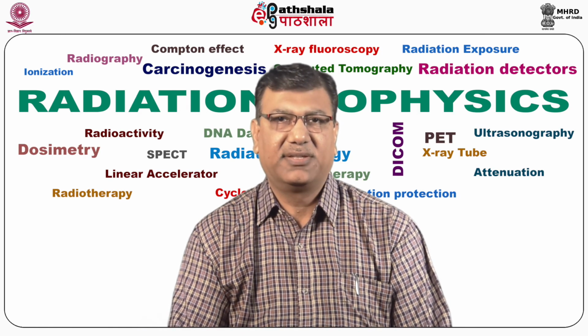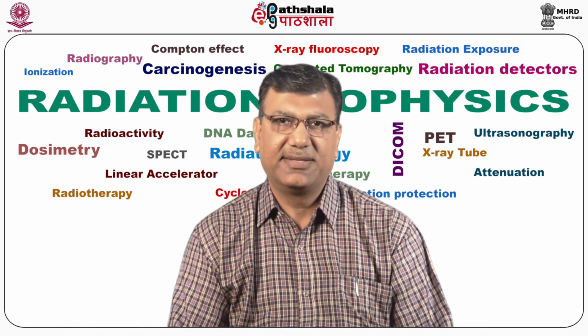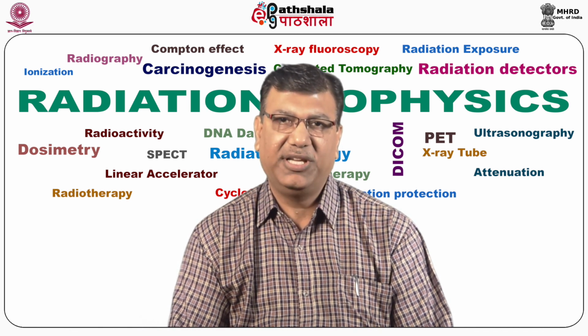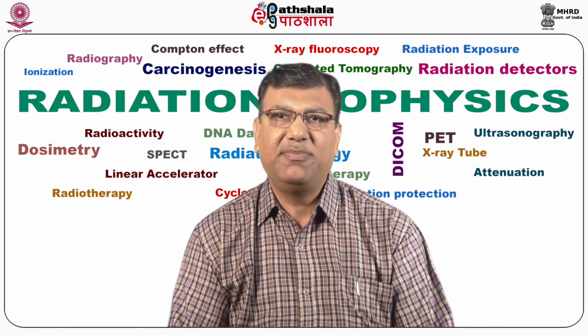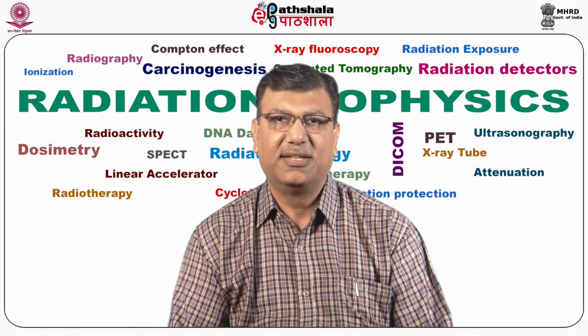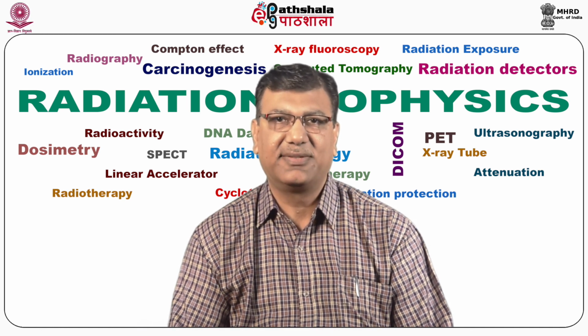Now the summary of this lecture: high dose rate brachytherapy has much improved treatment techniques. The size of the source is very small, 3 to 5 mm actual size. It can be used in most of the locations because of the small size. This high dose rate brachytherapy is useful for most types of cancers.